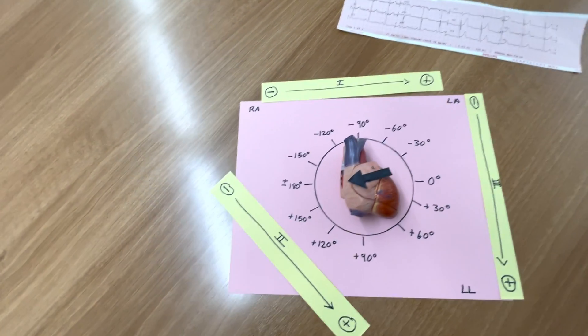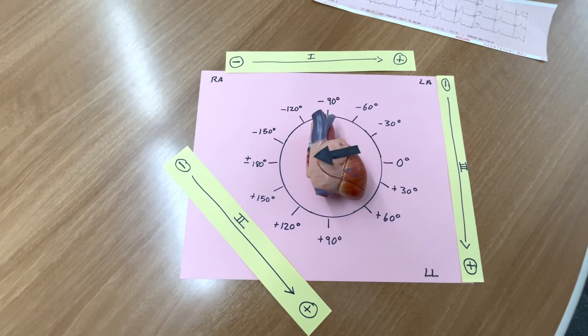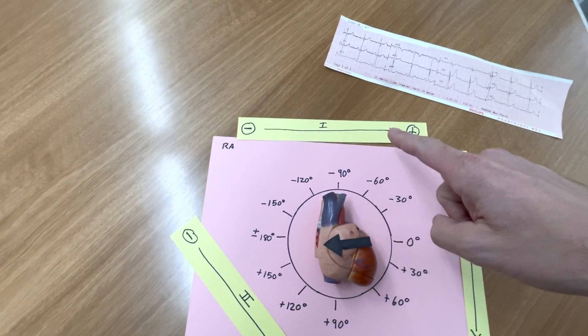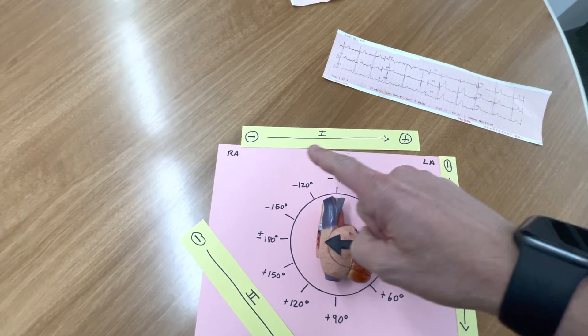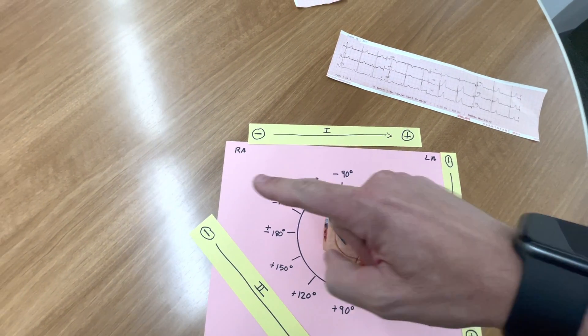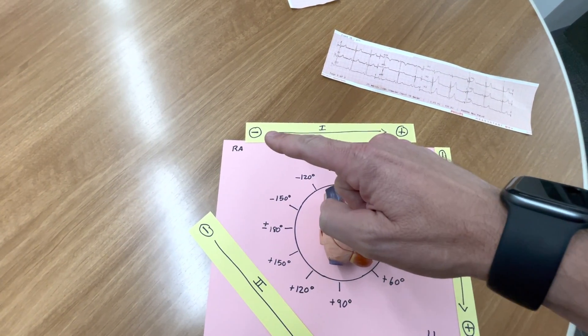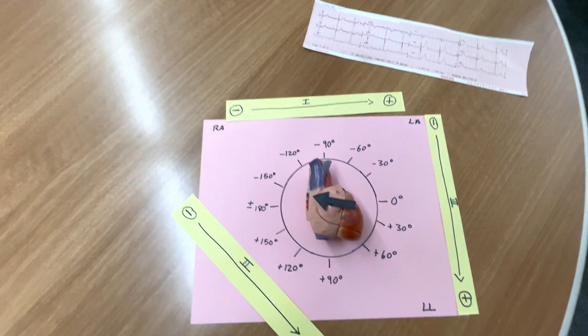Right axis deviation is considered plus 90 to about 180 degrees, in this range here. With right axis deviation, you're going to see that lead one is going to shift downward because that electrical activity is moving toward the negative electrode in lead one.